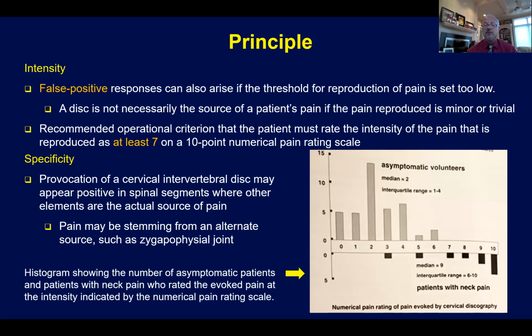So, for example, we're looking for no less than a pain level of 7 out of 10 on a numeric rating scale, provided that the pre-injection or pre-stimulation pain is about 30 or 40% below that. So it makes no sense to rate a patient's pain at 6 and then derive a 7 with stimulation. Contrarily, we wouldn't want to select patients who are describing pain at 2 or 3 out of 10. That makes no sense with a mild level of pain.